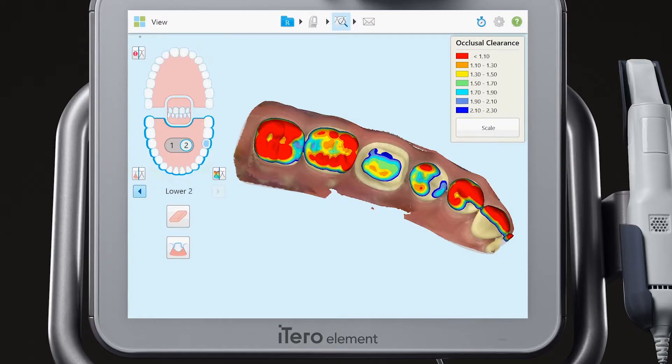After scanning the required segments for your restorative case type, tap the view icon at the top of the touchscreen display to view the digital model in high resolution.